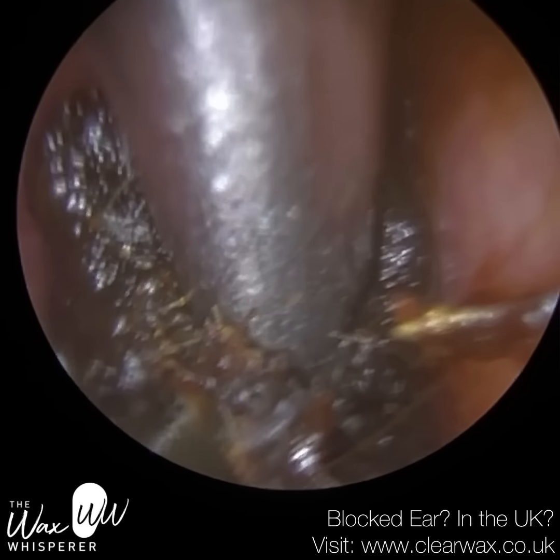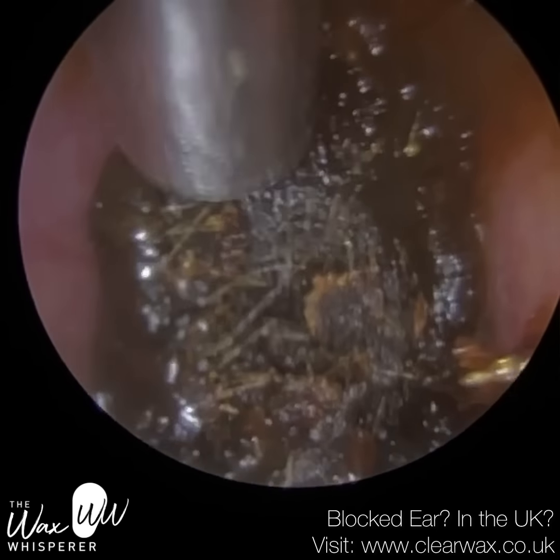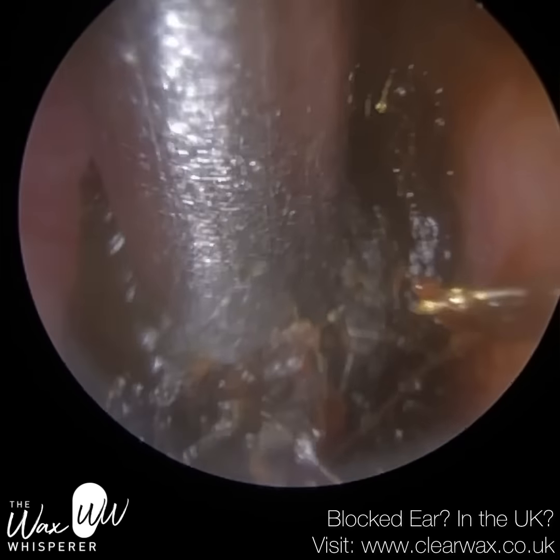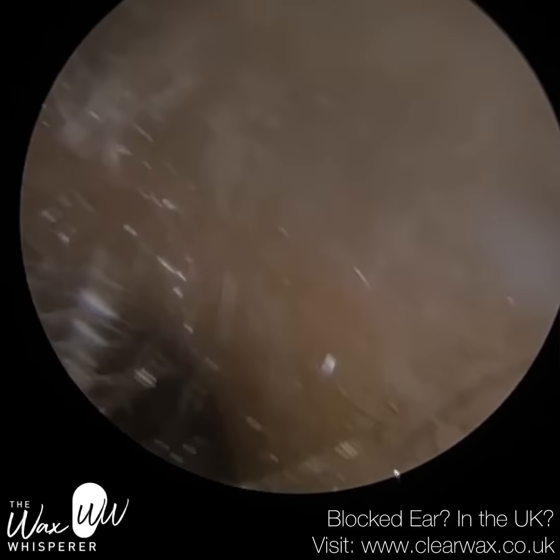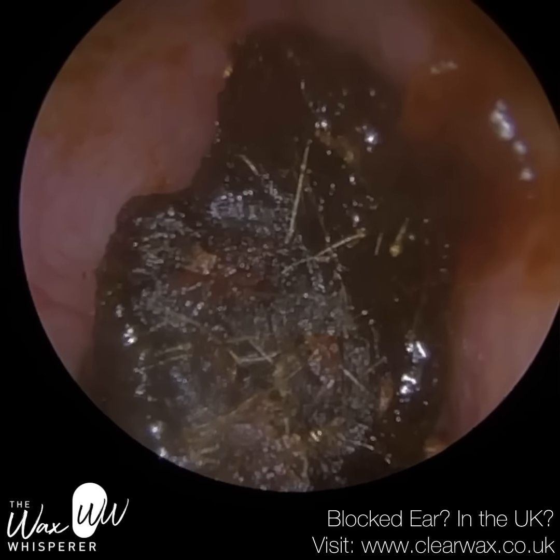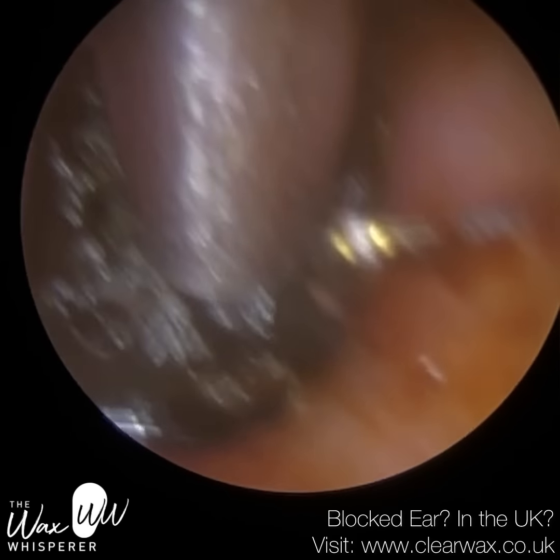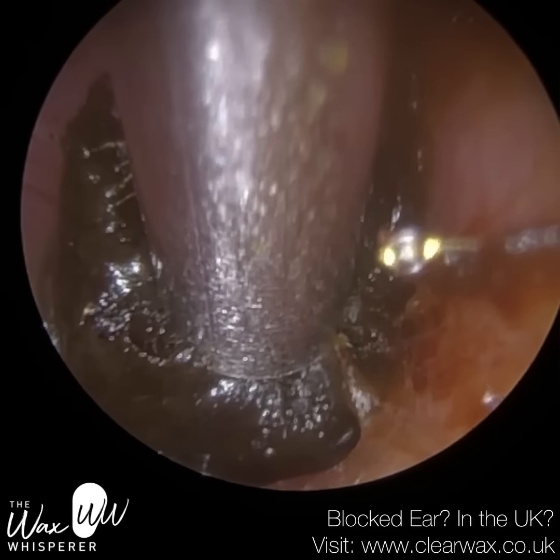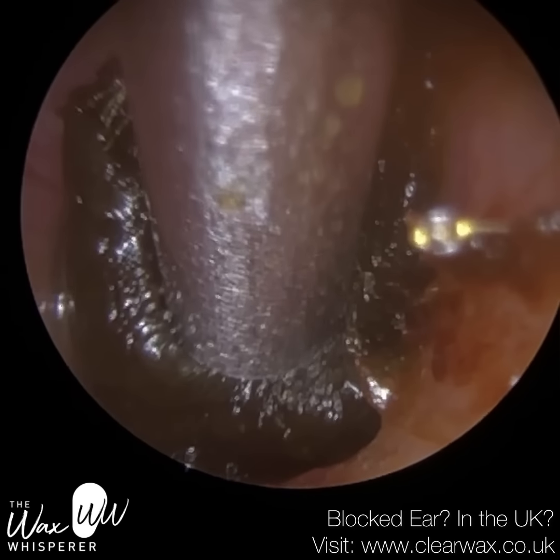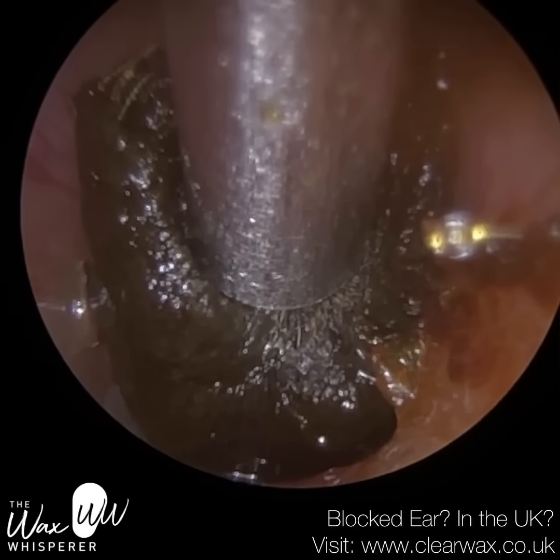I'm just trying to tease this away — trying not to embed the suction probe, otherwise you risk blocking it. So I'm just kissing the surface and slowly taking it away from the canal wall. It's just a bit blurry because of the oil. I'm going to try and get the endoscope around the hairs to avoid smearing. When you've got really protruding hairs like this there's always a chance of them smearing the lens of the endoscope as you enter.